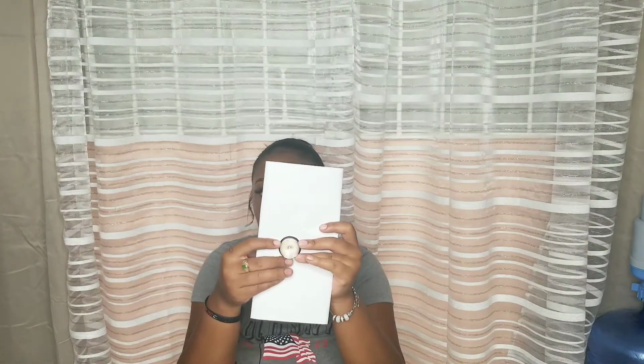So for amalgam, guys, to do the amalgam filling, as I said, there are a few instruments that you're going to need to do that. So the very first thing that I'm going to be showing you is an amalgam well. So this is what it looks like. It's like a little well, right? So what you use this little well for is you're going to get an amalgam capsule, right? You're going to put it in an amalgamator. It's like a shake it up, shake it up, until it turns into a ball. So when that process finishes after a few seconds, you empty the capsule in this, right?